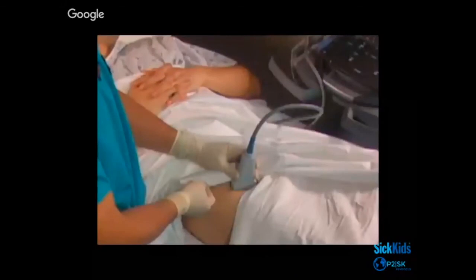But it's really up to you, find out which way you prefer. For sure, you want to use your dominant hand to move the needle in. And your other hand should be holding the probe. Some people have tried to have the probe held by someone else. That doesn't really work very well. I feel like if you have someone else available, use that person more to either record what you're doing or inject the medication. But the person doing the procedure should at least have the probe and the needle in their hands.